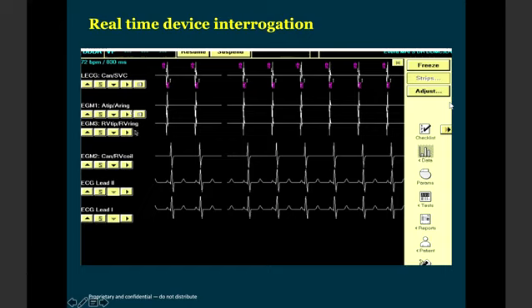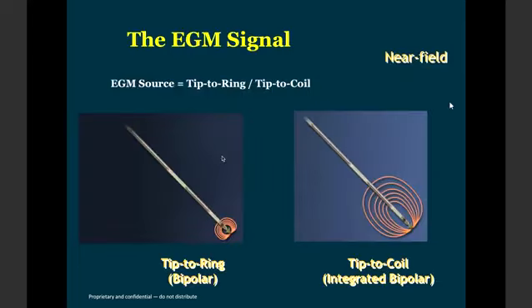It is right at the tip of the electrode of the lead, so it's a near field electrogram. CAN to coil is a big distance, so it gets a lot of additional information. That's why we call it a far field EGM. So that is the leadless ECG, the atrial electrogram, the near field ventricular electrogram, and the far field ventricular electrogram.